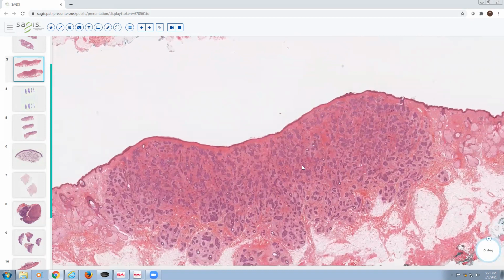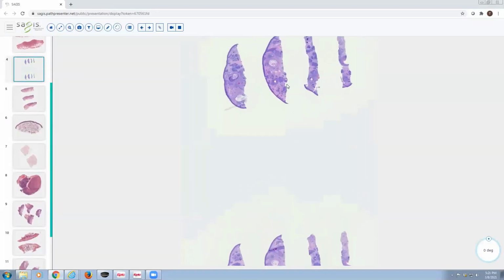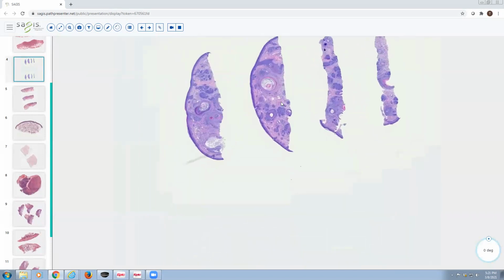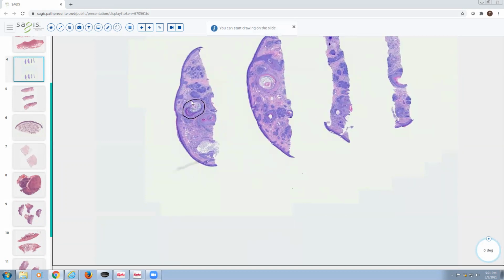But you don't see follicular cysts with keratinization inside the cysts. In a trichoep, however, you will see some of those follicular cysts with infundibular keratinization. And that indicates a little bit more terminally differentiated or less primitive type of differentiation here.